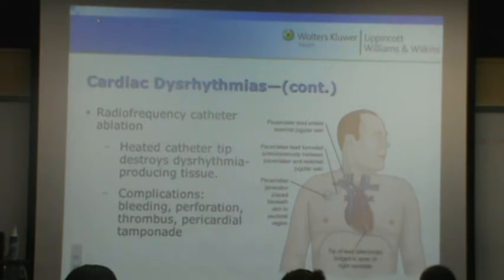So if we have to defibrillate a patient and we see that they have some type of implant, because in the field, a lot of times you may not know whether it's an internal defibrillator or a pacemaker. They look the same from the outside. So make sure you don't place your pads over it if we're having to defibrillate them.